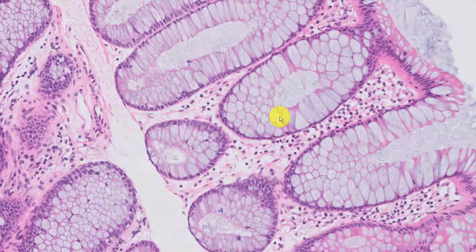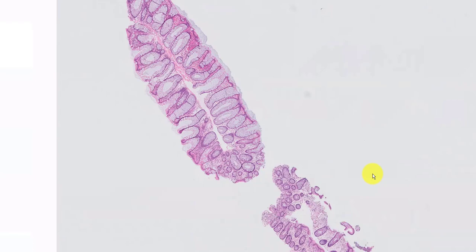Another useful feature would have been the thickening of the basement membrane, which is often seen in left-sided hyperplastic polyps. Unfortunately, it's very muted right here. Bottom line, this is a goblet cell rich hyperplastic polyp.